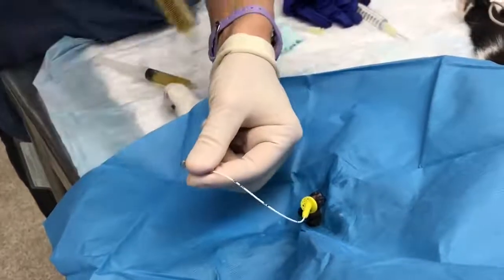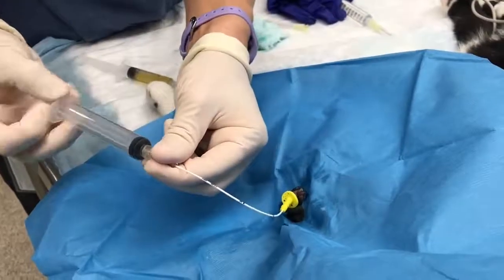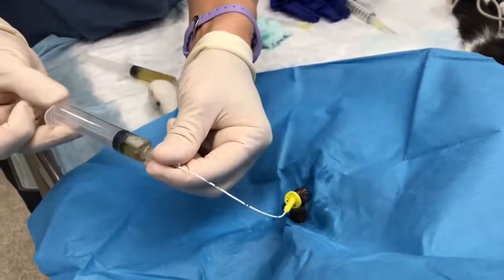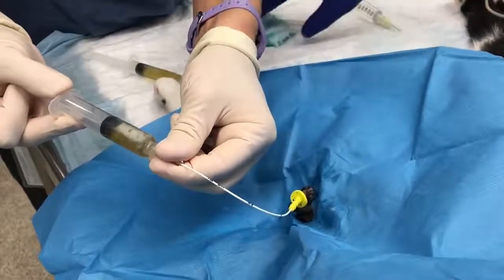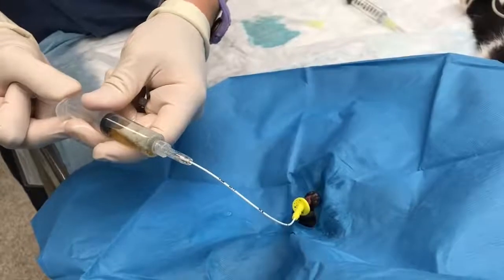If the urine isn't flowing easily, the urinary catheter position may need to be adjusted. You may pull gently back on the urinary catheter until the urine flows easily, as seen here.